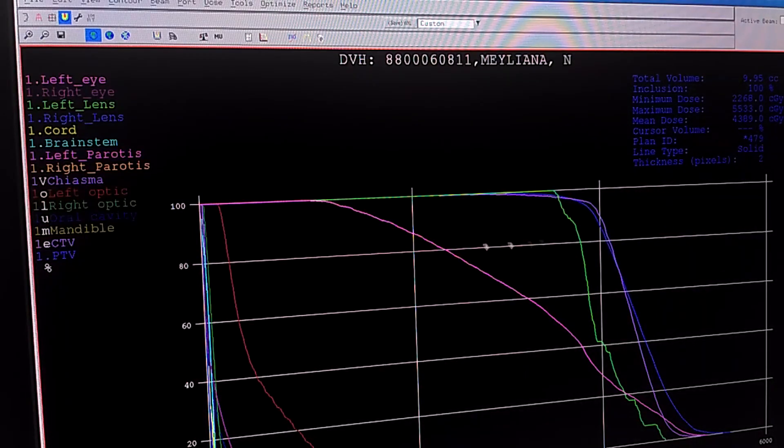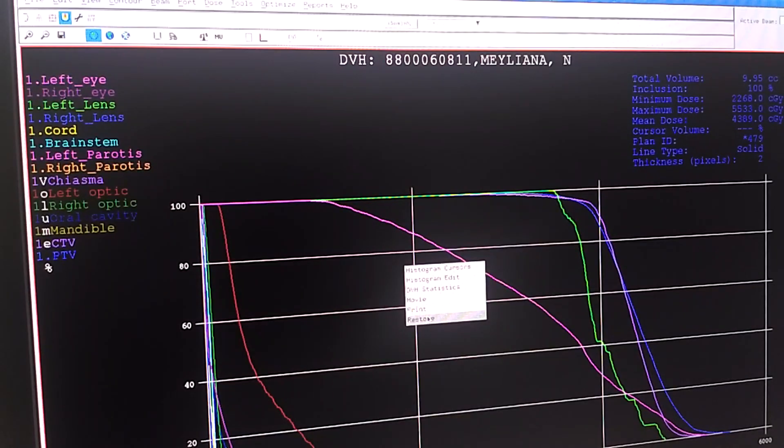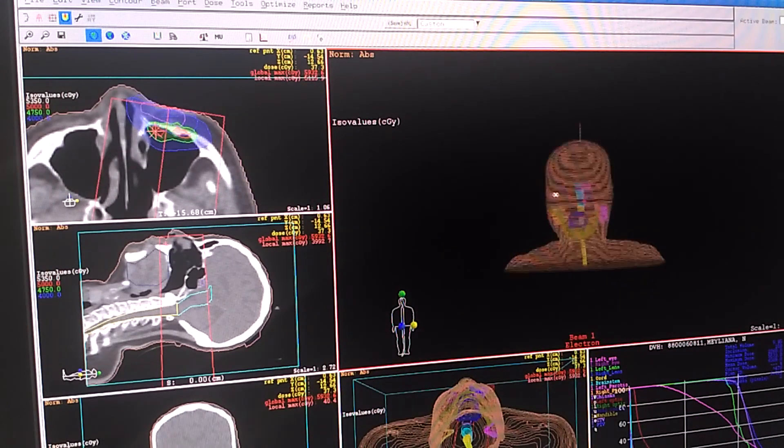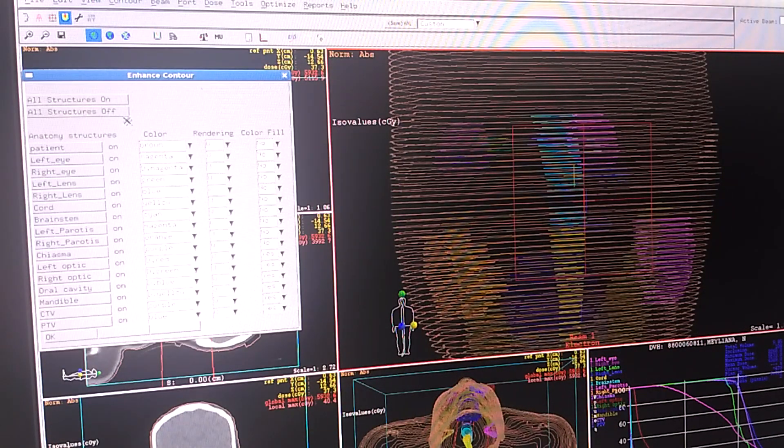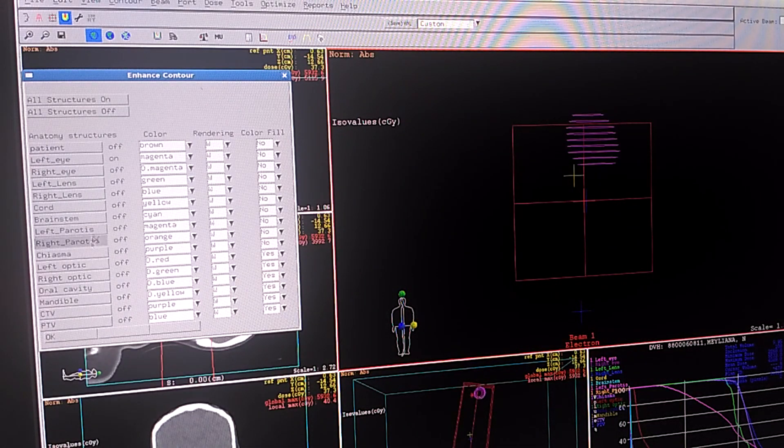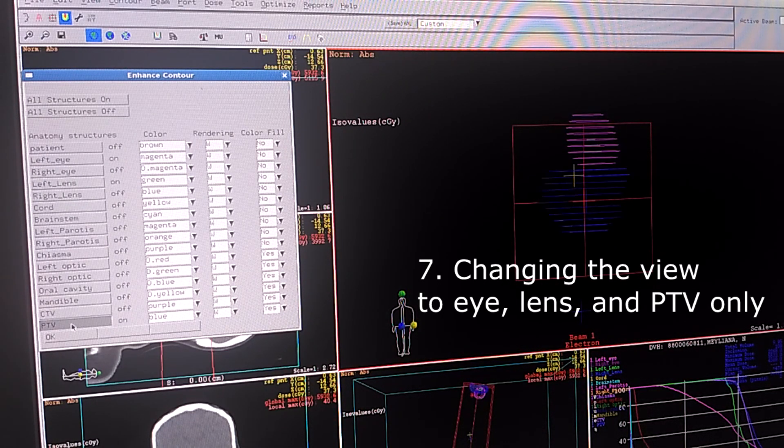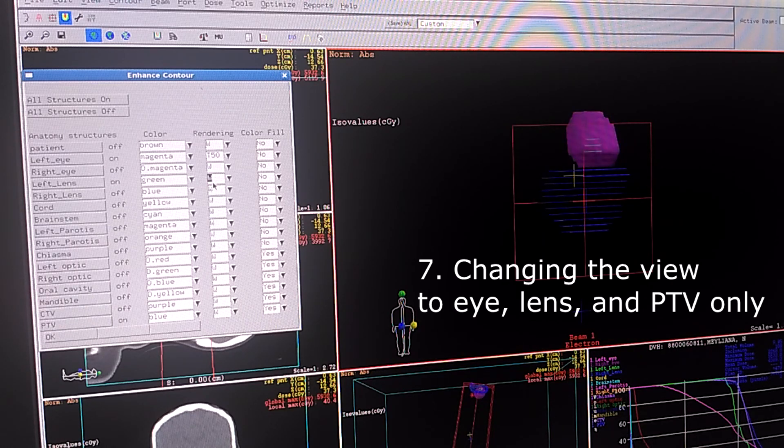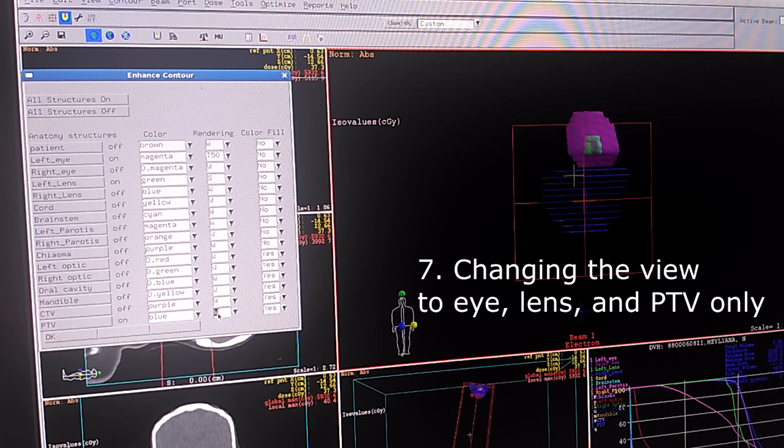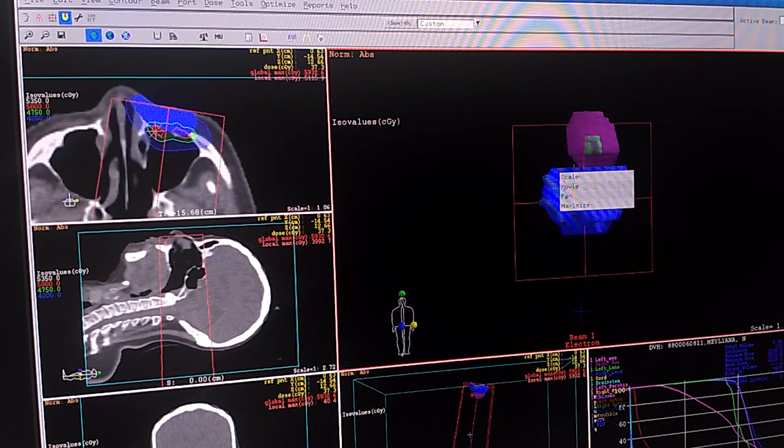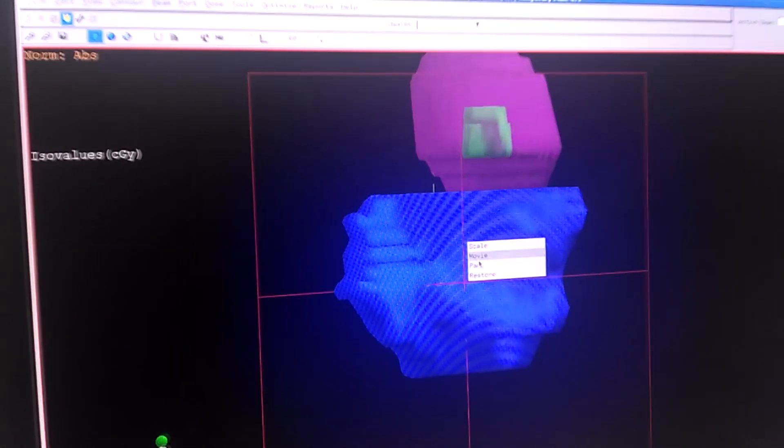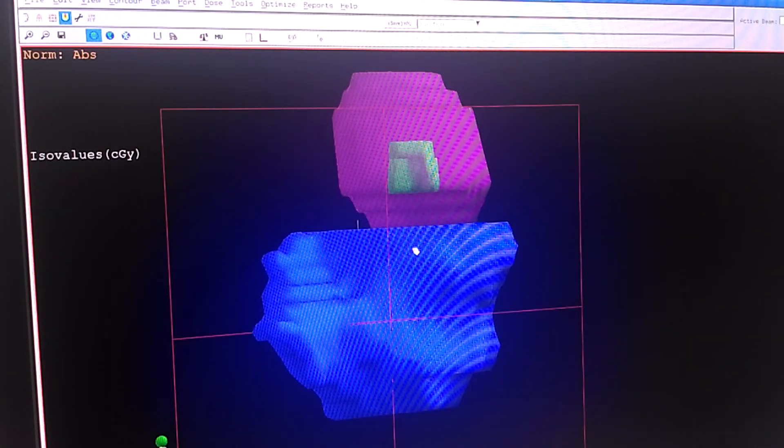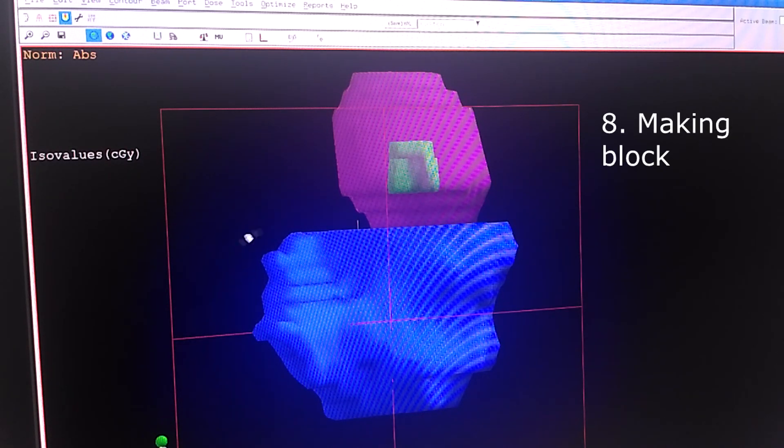So we are going to block it using block. I'm going to turn off all the structures except the eye, the lens and the PTV. I'm going to change the rendering so we can see it better here and I'm going to maximize this one.